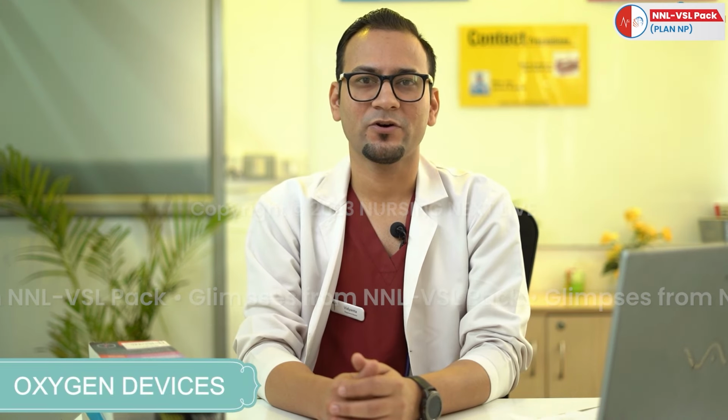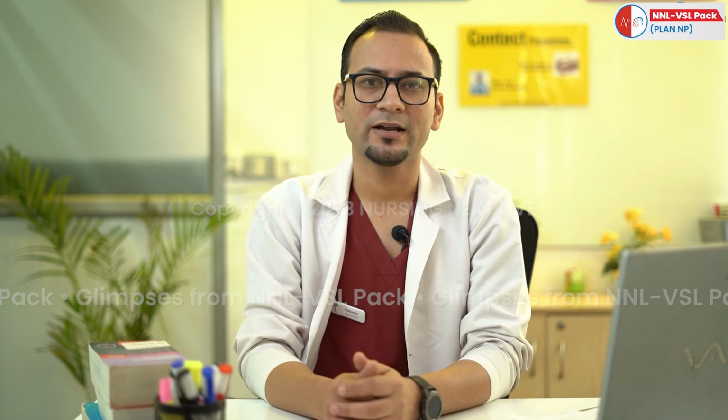In this video, a nurse will understand the various aspects of oxygen devices, method of administration of oxygenation, its uses, indication and contraindication. Air, water and food are the essential components of life. Oxygen is a major component of air. Some patients with breathing difficulty cannot get enough oxygenation, so they require an additional amount of oxygen, either in the form of an oxygen cylinder or central supply. They can be administered as a part of medical intervention.